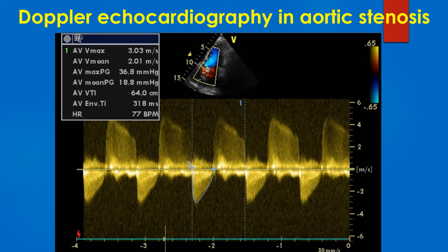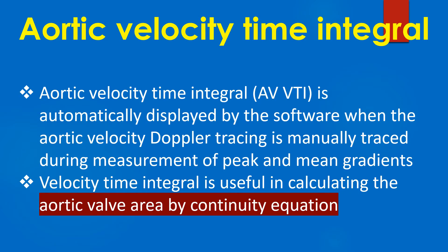The image also shows an aortic regurgitation jet which is above the baseline, but the measurements of the AR jet are not shown here. Aortic velocity time integral is automatically displayed by the software when the aortic velocity Doppler tracing is manually traced during measurement of peak and mean gradients.